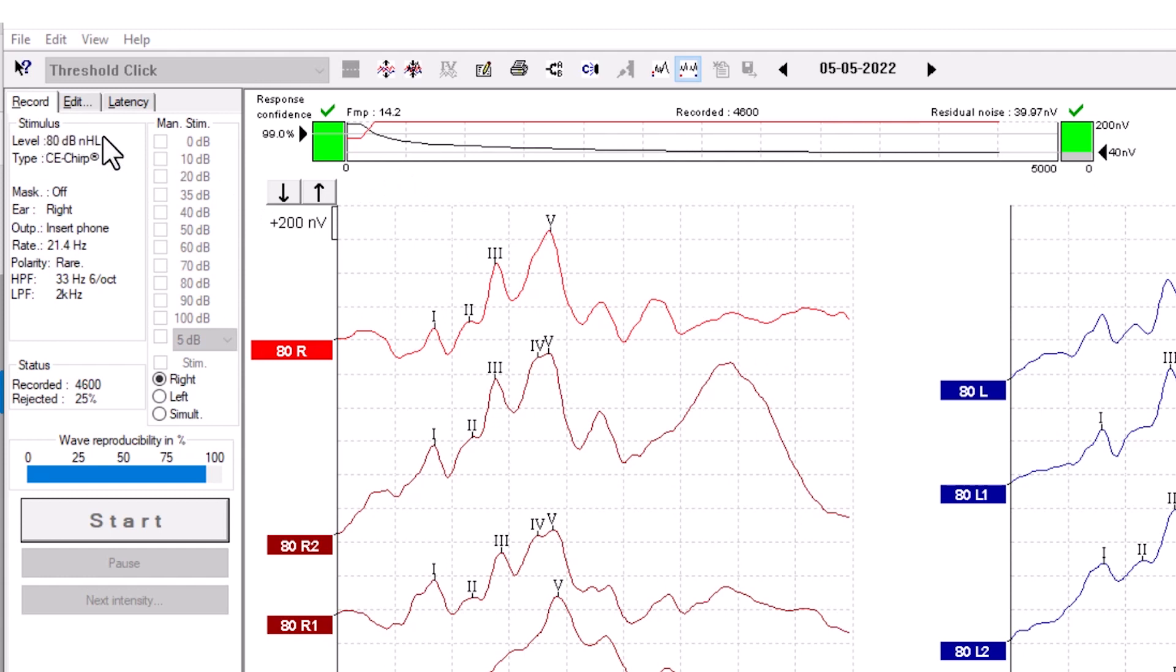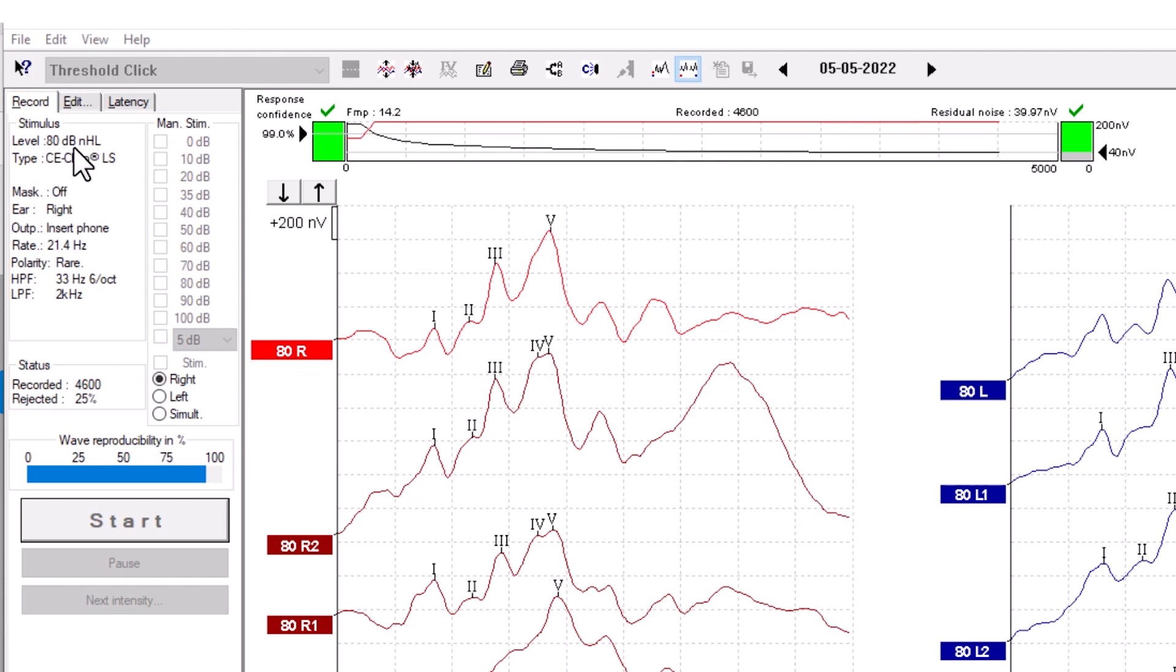The stimulus window shows the stimulus parameters for the curve being recorded or the chosen highlighted curve. You can see what intensity and which stimulus types have been used.